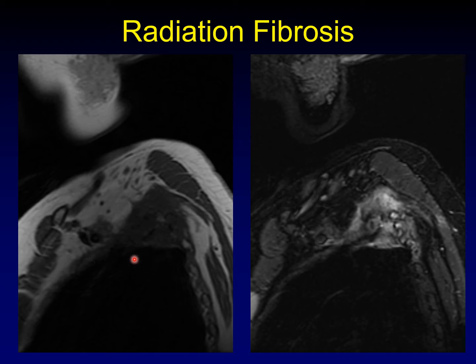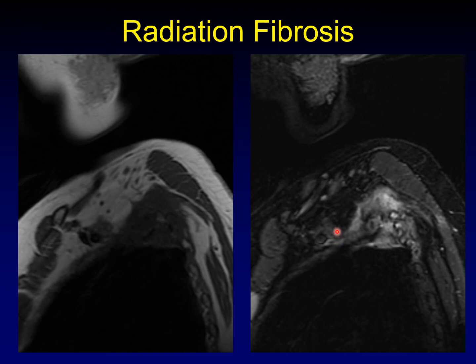We look to our T2-weighted images. The larger mass is heterogeneously bright on T2, just as you'd expect an aggressive tumor to be. The radiation fibrosis, however, is T2 dark. Tumor is T2 bright, radiation is T2 dark — because radiation fibrosis is mostly fibrous tissue, and we expect that to be dark on both T1 and T2.